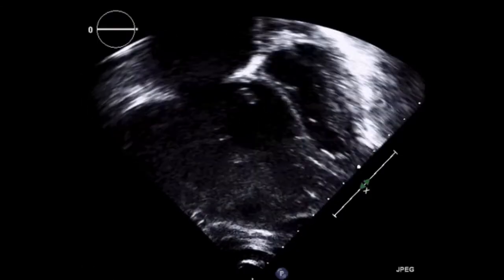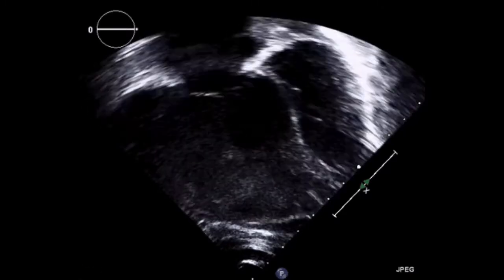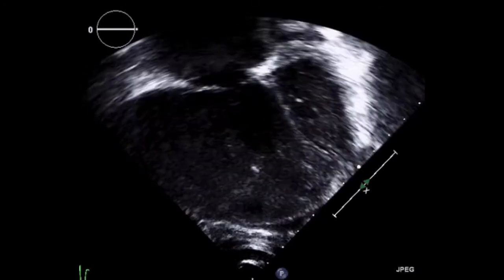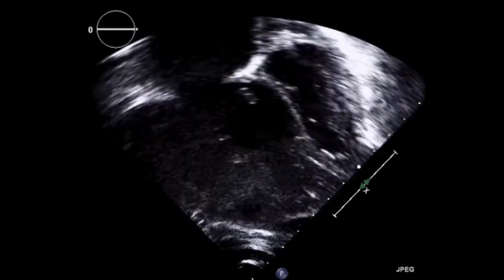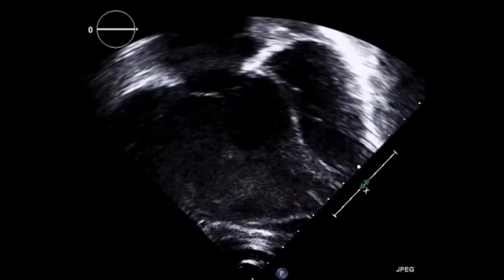This is an example of a patient with significant pulmonary hypertension, RV dilation, and really depressed RV performance and function. There's a big RA on top of it, and there's probably both systolic and diastolic dysfunction, and the LV looks completely pancaked. You can also appreciate some degree of pericardial effusion, and that's usually a finding that we see in some of these patients with severe pulmonary hypertension.